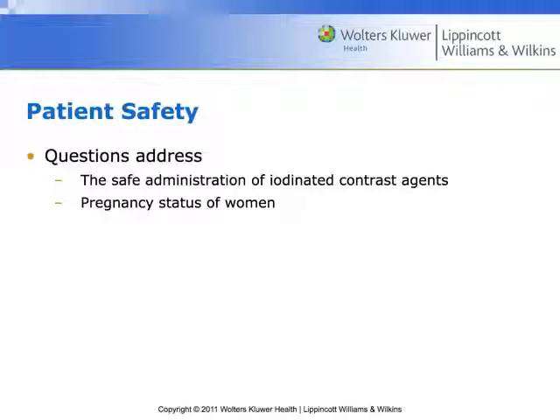So I want to make sure that thing can take some pressure, and that it's secure, it's locked in place. Also, one thing, when our patients bring their arms up for like a CT of their chest, what did I just do right here if I've got an IV in the antecubital?